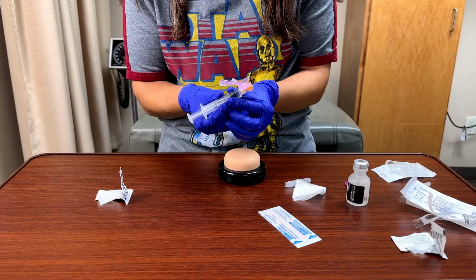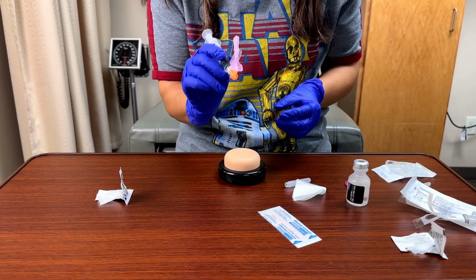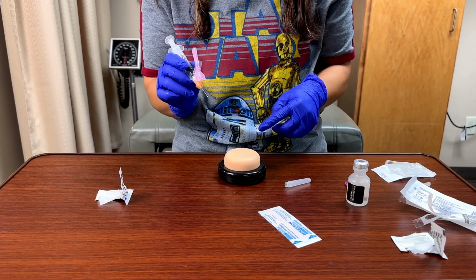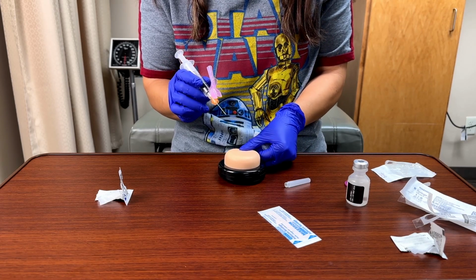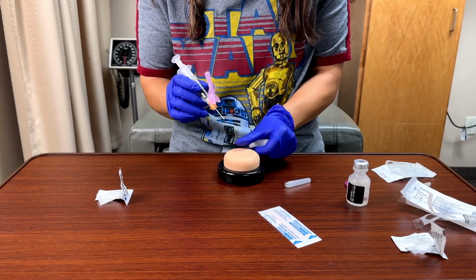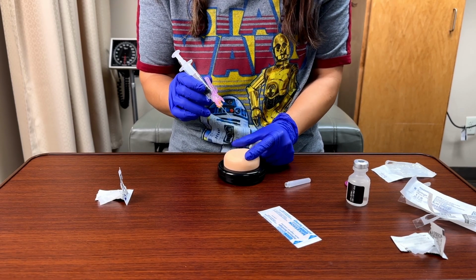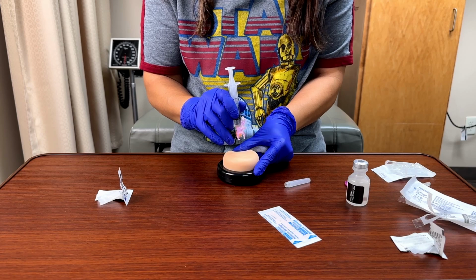So an intramuscular injection is going to be at 90 degrees. So I'm going to hold it kind of like a dart. Okay, I have my little gauze. This area has already been cleaned. So I'm going to pull it tight. I usually do it with a thumb, or I can do a kind of a two-fingered spread apart. And I'm going to pull, and I'm going to inject at 90 degrees.